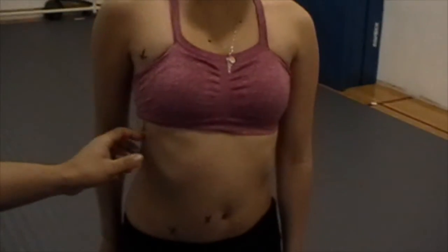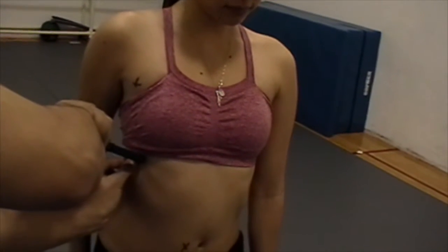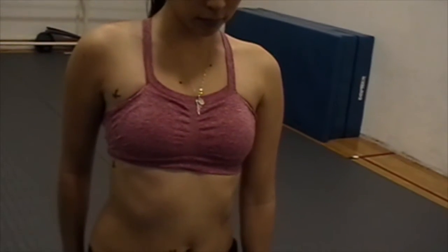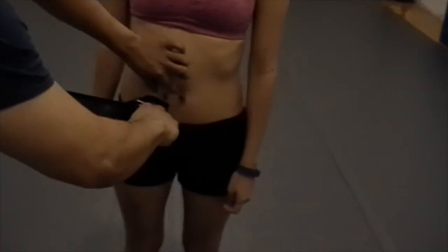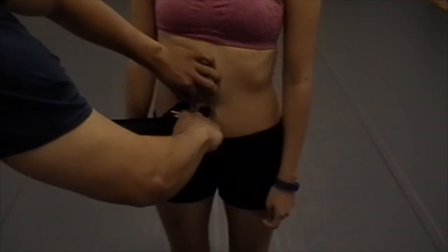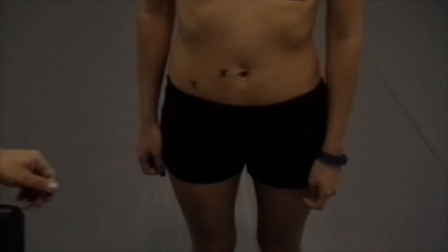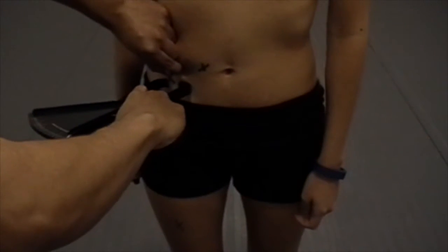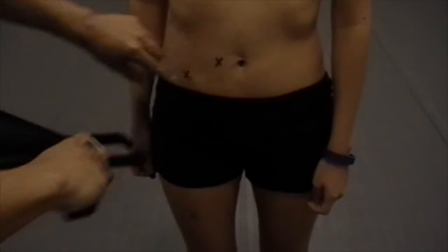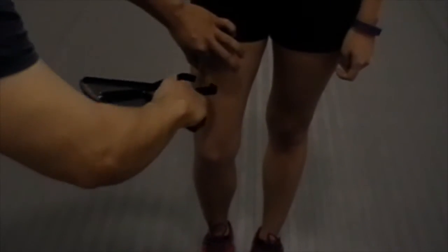Next is the mid-axillary, a vertical fold. Next is the abdominal, a vertical fold. Next is the suprailiac, a diagonal fold. Last is the thigh, a vertical fold.